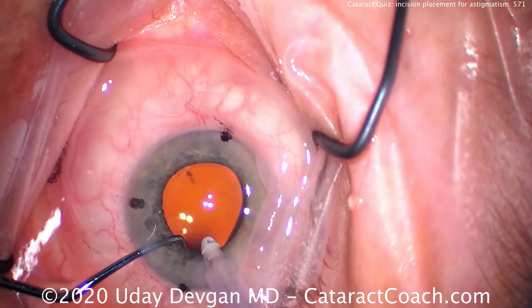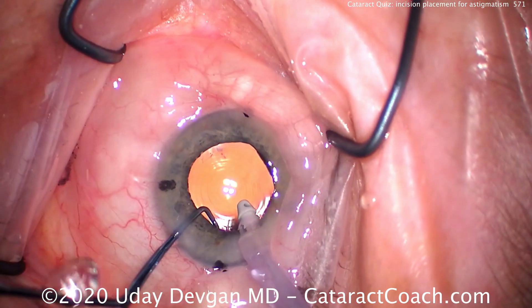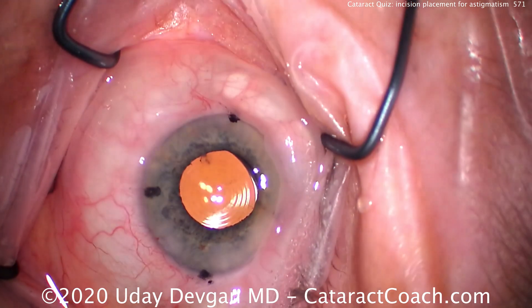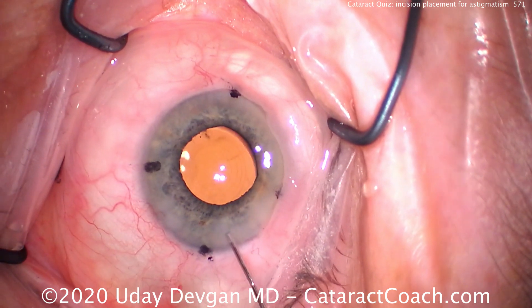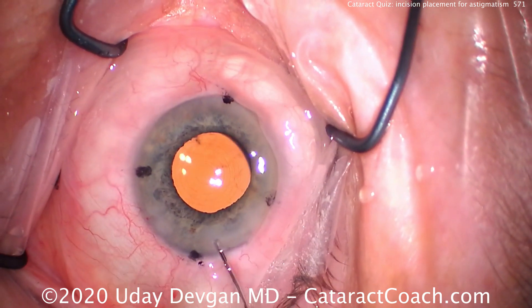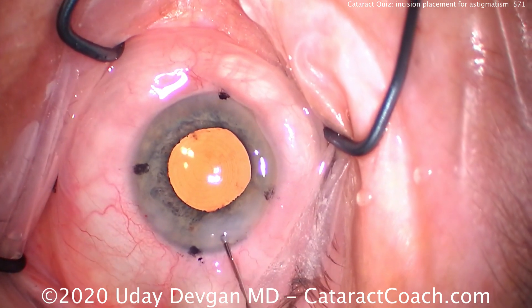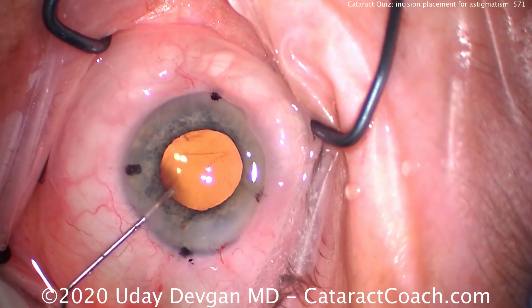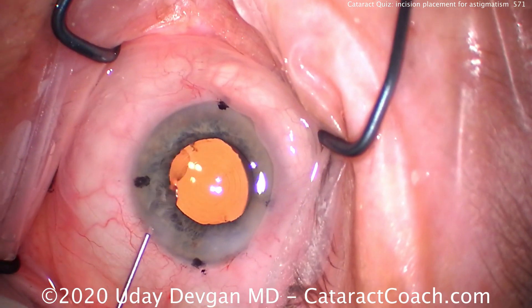By keeping the incision on the steep axis, or even the flat axis, you won't change the meridian — you'll simply change the total amount. So the answer to the quiz is: it's always best to make the incision on the steep axis. Second best, which is acceptable, is to make it on the flat axis and then simply increase the power of the toric lens. The last choice, which to avoid at all costs, is to make it oblique to the steep or flat axis.